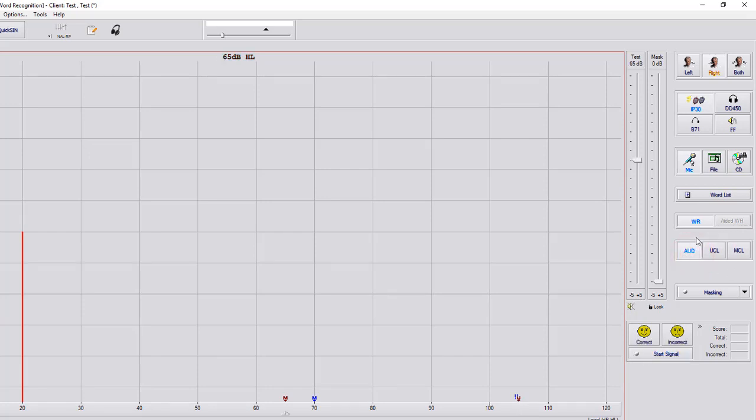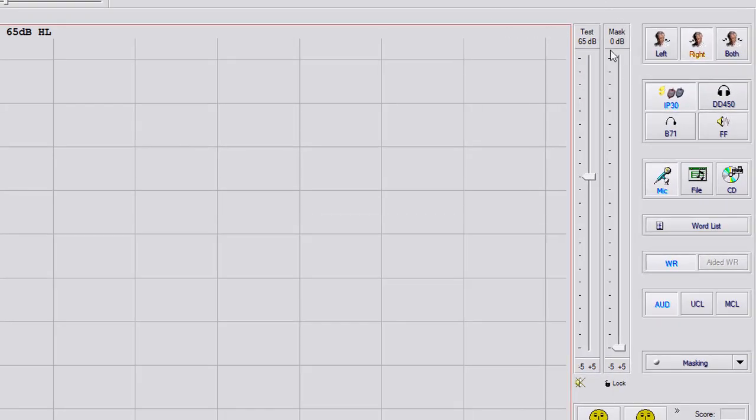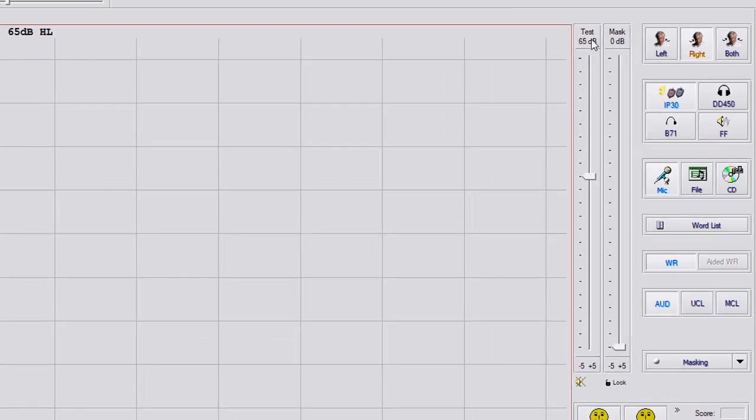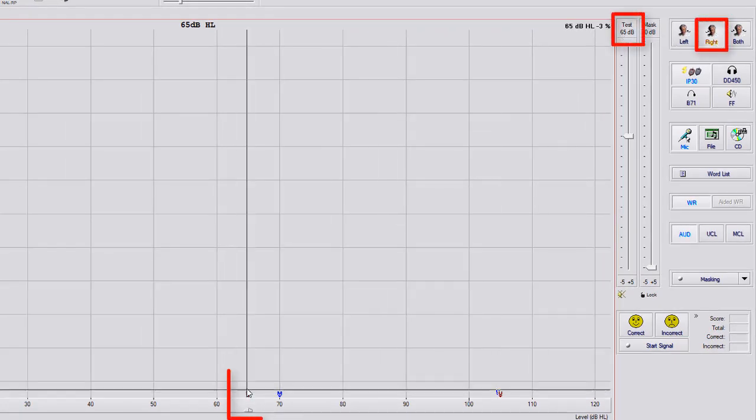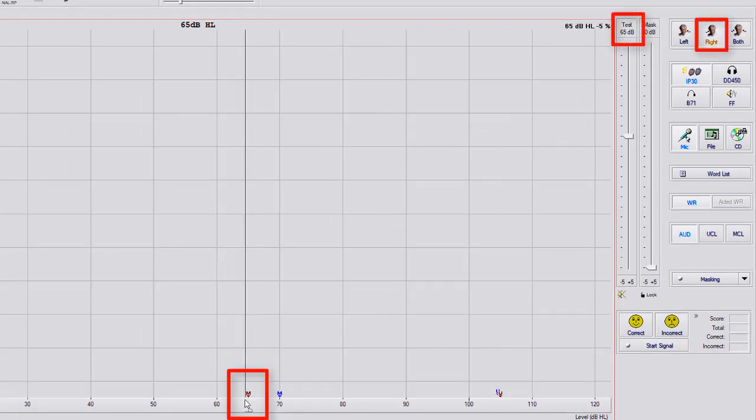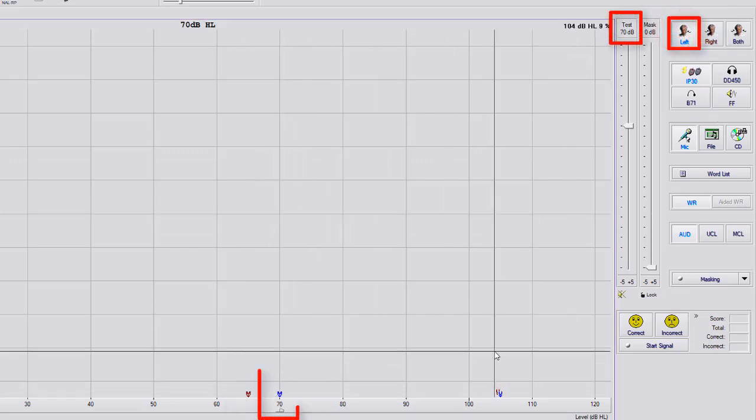Once you have your MCL, you can go back to AUD and now your test signal is going to start at your MCL. So for the right ear, we're at 65, which is where your marker is down here at the bottom. If you go to left ear, it's going to go up to 70, which is where your marker is at the bottom.